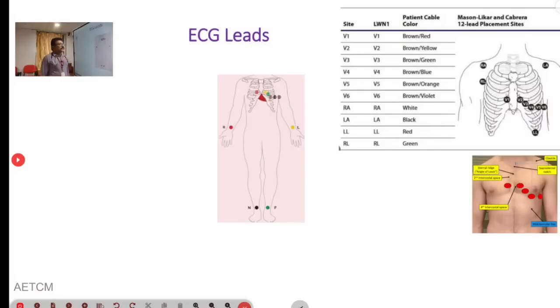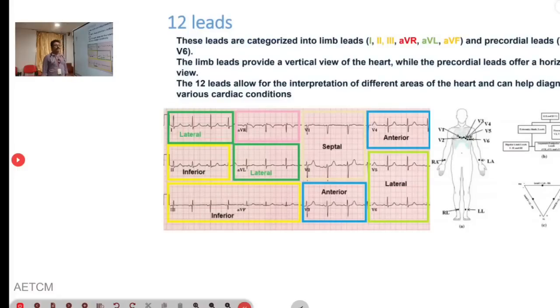So you know that ECG is taken with 12 leads in your ECG paper, but we can see how we are connecting the limb leads here. One is in the AVR, AVL, left foot, and chest leads. So these are limb leads. These are chest leads. Okay, we'll not discuss that now. We'll see while taking ECG. We'll see each lead separately.